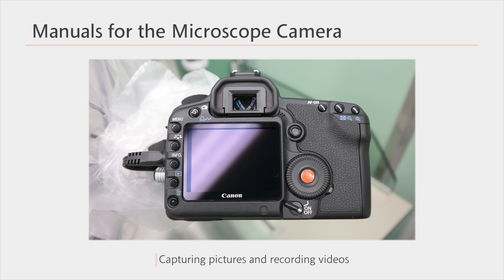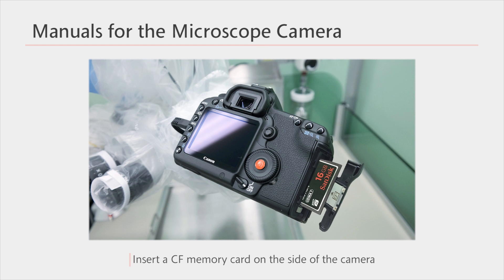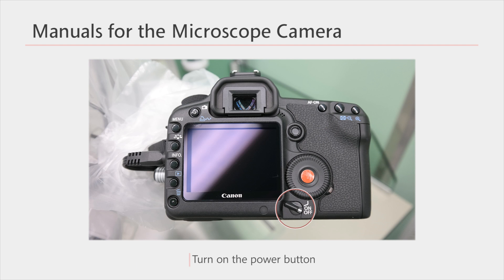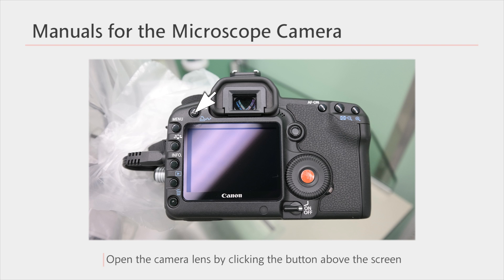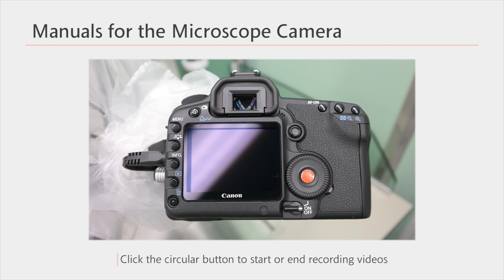There is also an attached camera on the microscope for capturing pictures and recording videos. In order to use the camera, a memory card as shown here is necessary. Open the cover on the side and insert a memory card. Turn it on by turning the lever to on. Open the camera lens by clicking the button above the screen and now you're ready to use the camera. If you press the shutter button on the remote control, a picture will be taken. In order to record a video, you can press the circular button as shown here. You can end the recording by pressing it again.